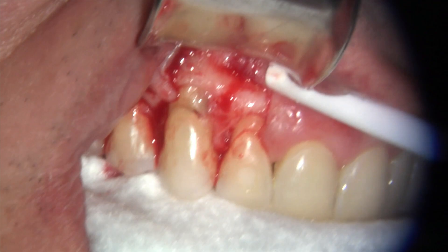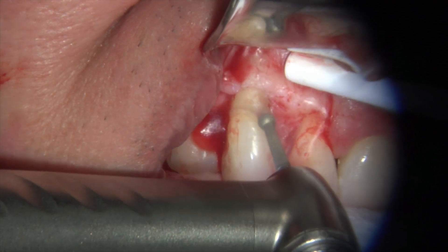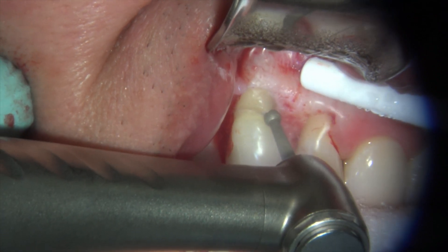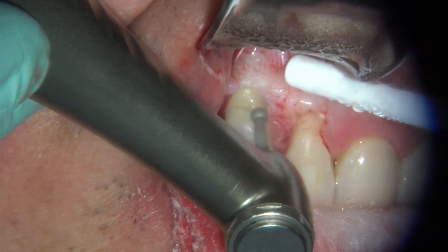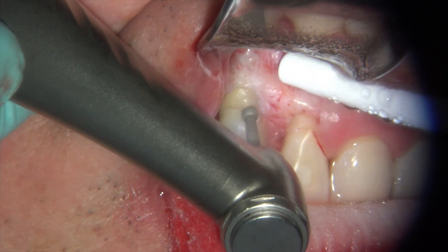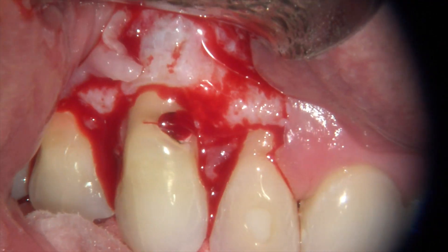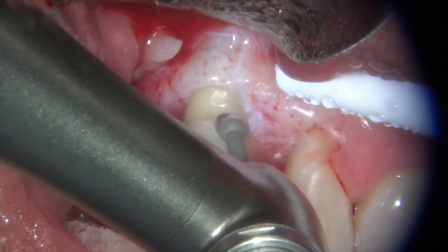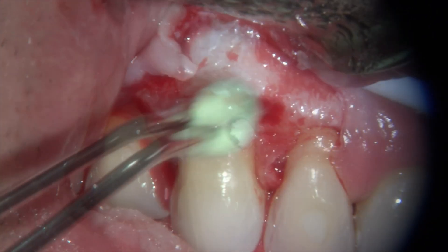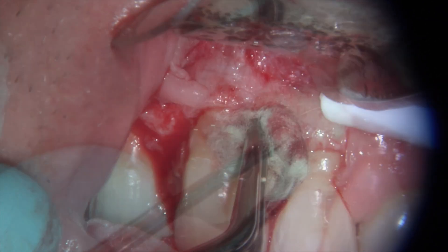There was already a gingival black triangle in the mesial area of the canine, indicating some recession as a result of the resorptive defect. Once we expose the area, we remove the resorptive tissue using a diamond bur, creating a nice pocket that can then be filled. Epi pellets are used to control bleeding, and you really have to have a very dry field before you can place the BC liner.